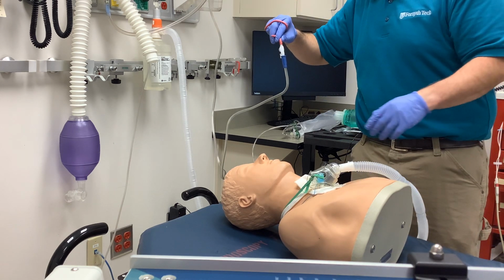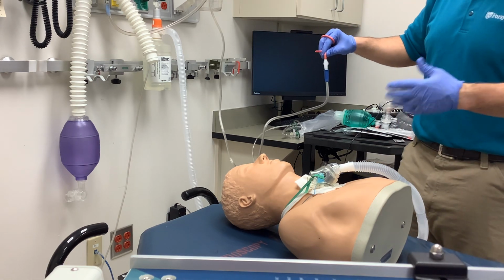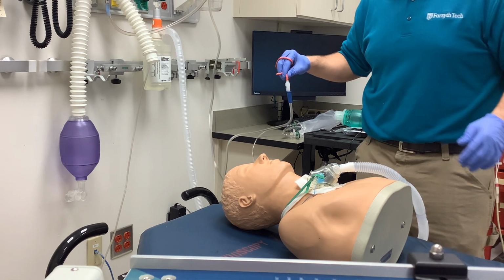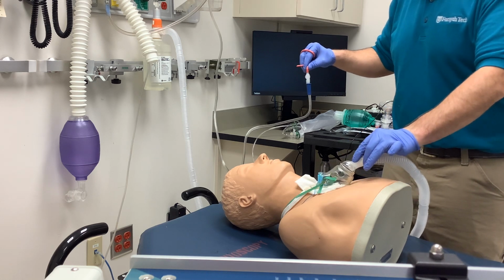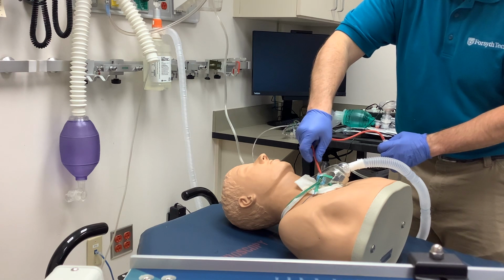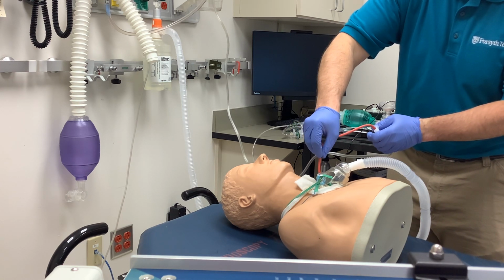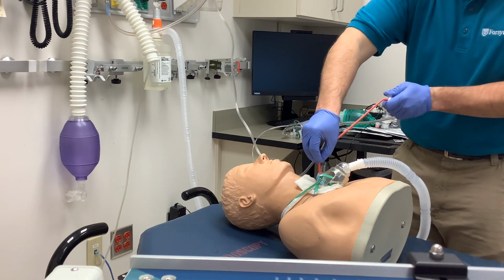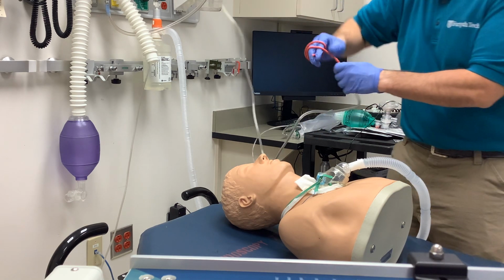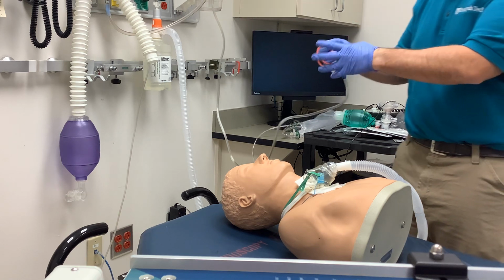pre-hyperoxygenate again, post-procedure. So if you do an assessment, and a lot of times the patient's with it and coherent enough, I'll ask them, do you feel like we got it all? Do you feel like I should make another pass? If they nod yes, I'll say, okay, catch your breath, we'll make another pass. Ready to make another pass, pull this down, maintaining sterile technique, go down the tracheostomy tube till you meet your resistance, pull back, apply your suction, rotate your fingers back and forth, and now you can post-hyperoxygenate while you dispose of your catheter.